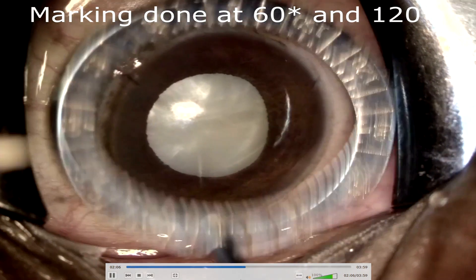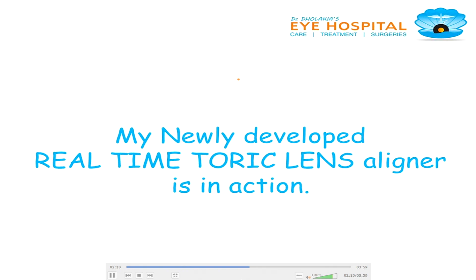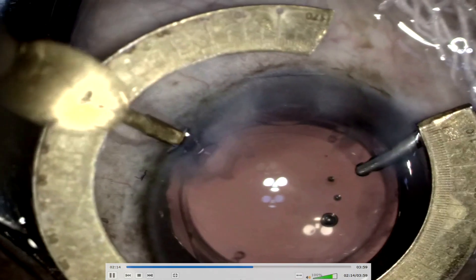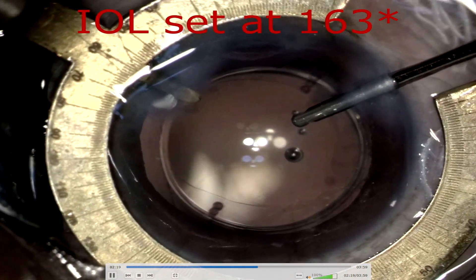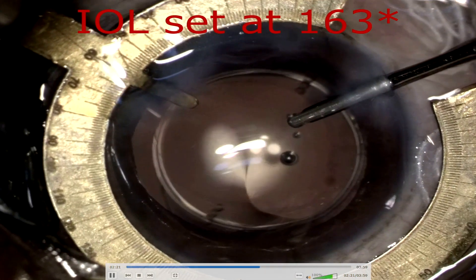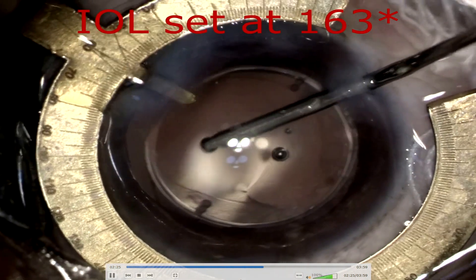The side port will be placed there. Intraoperative real-time toric IOL alignment using our tool — my newly developed real-time toric aligner is in action. Once the irrigation-aspiration is completed and all viscoelastic is removed, we introduce the toric lens aligner into the eye through one side port by the spur.